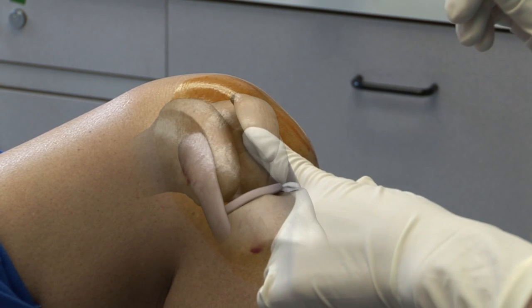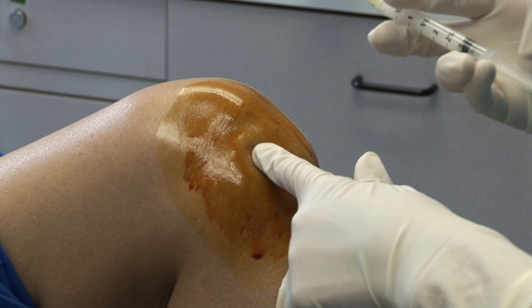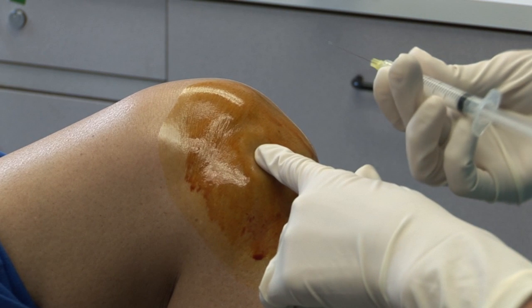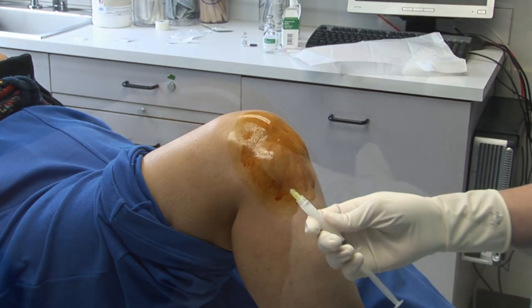Just lateral to the patellar tendon is an easily palpable sulcus. Wearing sterile gloves, palpate the cleansed area to reconfirm the injection site with the left hand. Maintain sterility of the left hand throughout the procedure. With the right hand, remove the needle guard from the syringe topped with a 27-gauge needle without contaminating the needle.